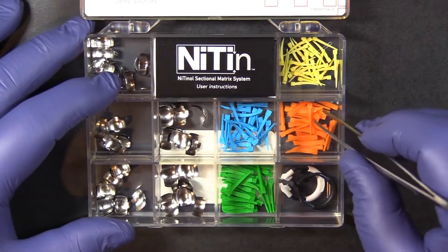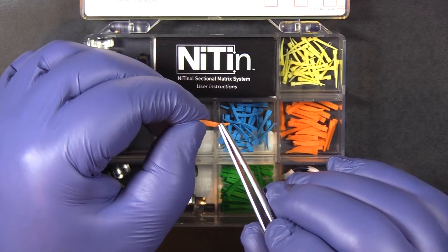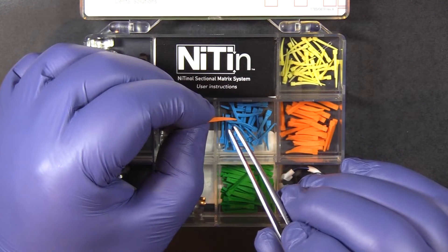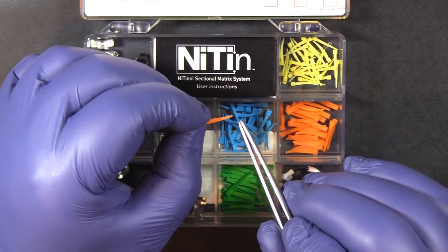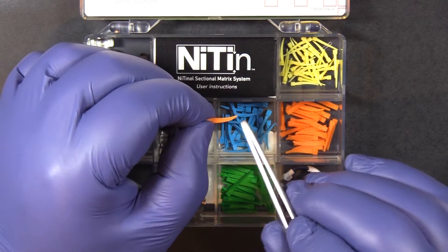Four sizes of wedges — all sides of these have a nice curve to help prevent putting flat spots in the matrix band and subsequently in your restoration. The bottom side of the wedge is very smooth and nicely rounded so it doesn't tear up the papilla or your rubber dam during placement.